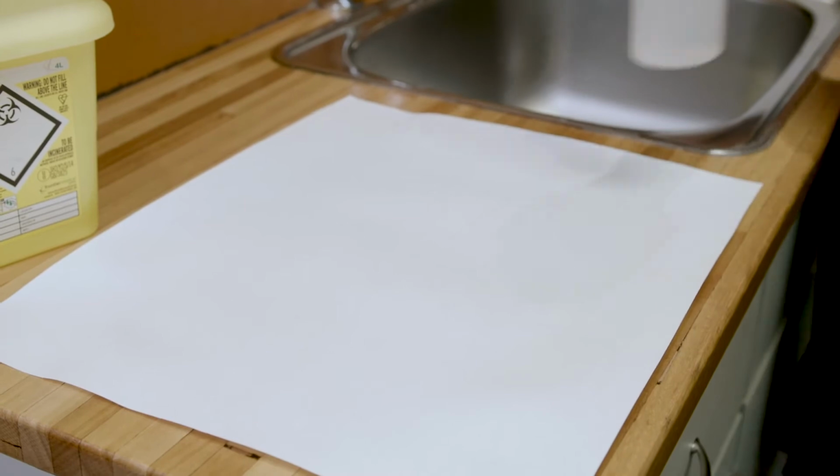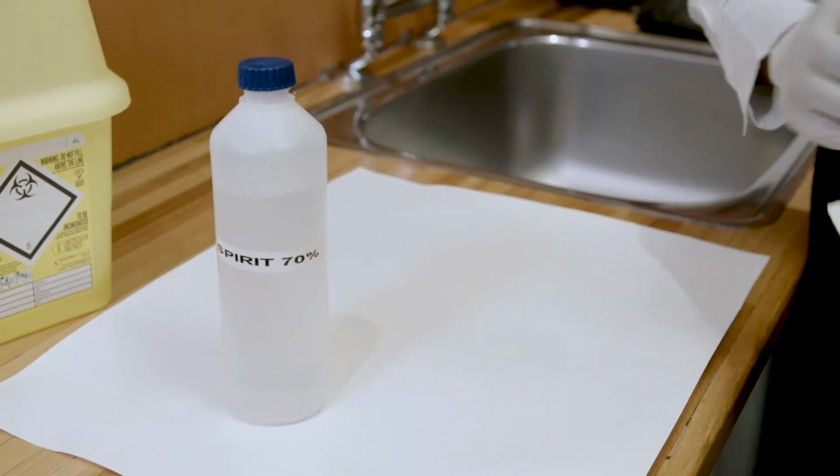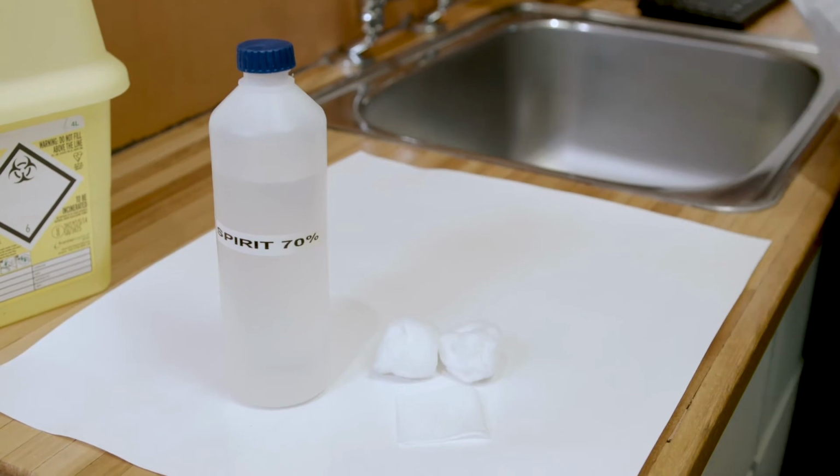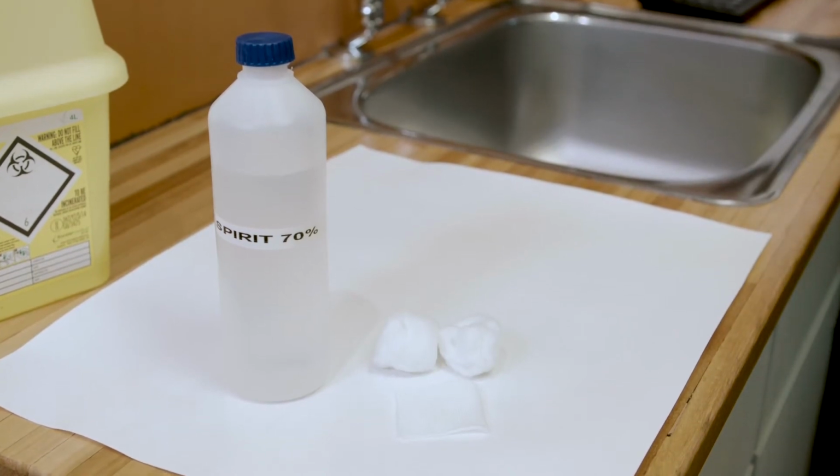Next, you will need skin disinfectant. The DBS collection bundle includes individually packed gauze swabs with alcohol. If you are not using a bundle, you will need gauze or cotton wool moistened with alcohol or spirits.